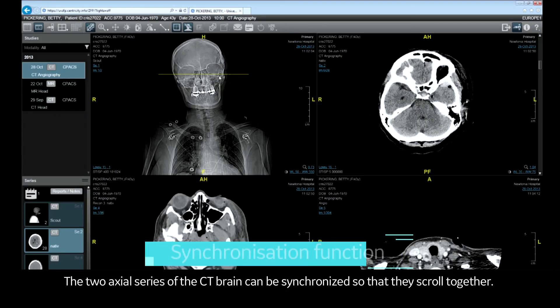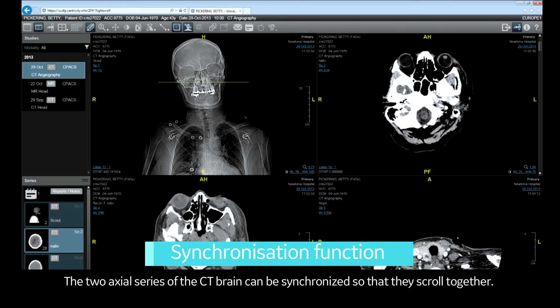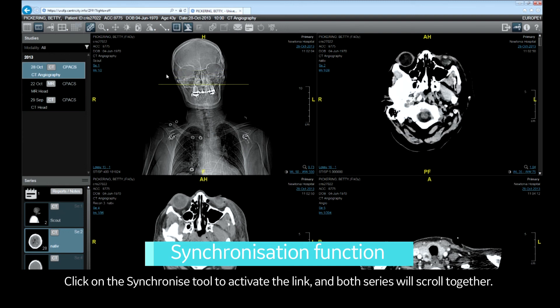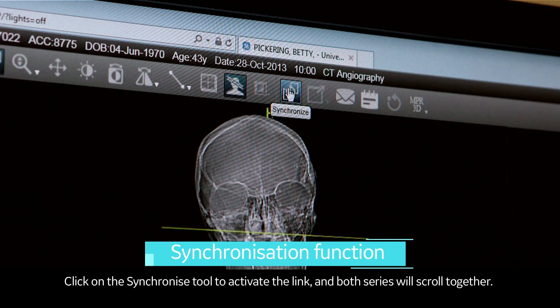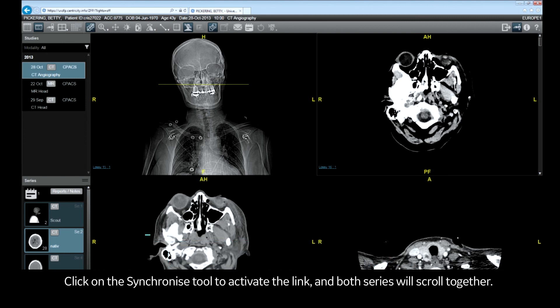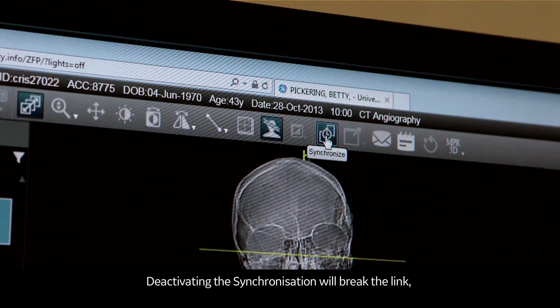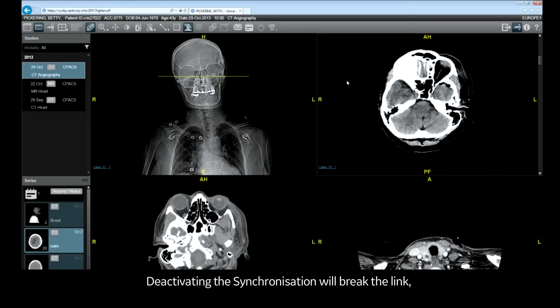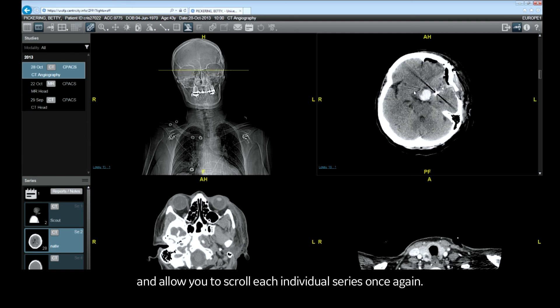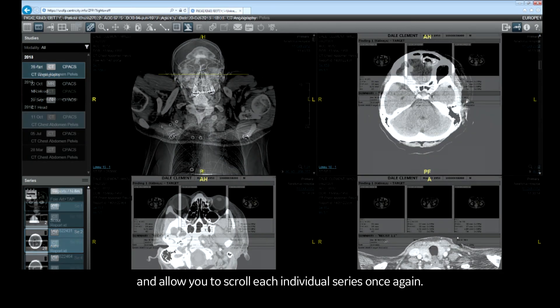The two axial series on the CT brain can be synchronized so they scroll together. Click on the synchronize tool to activate the link and both series will scroll together. Deactivating the synchronization will break the link and allow you to scroll each individual series once again.